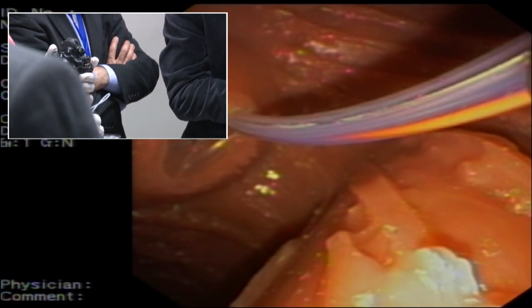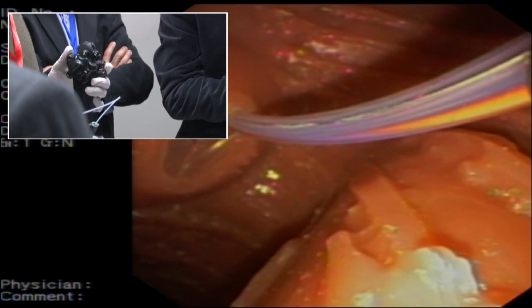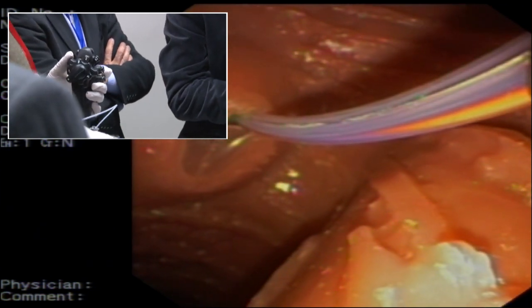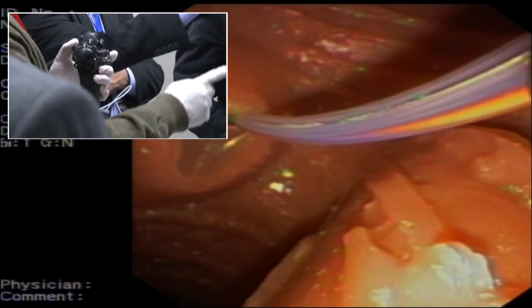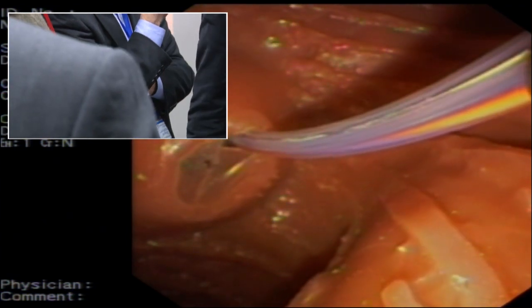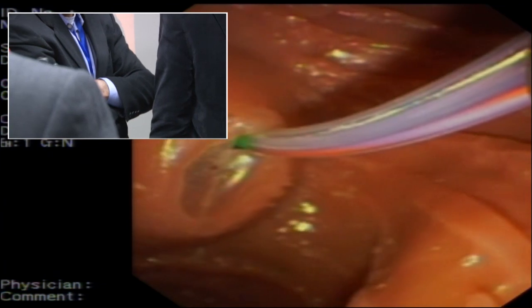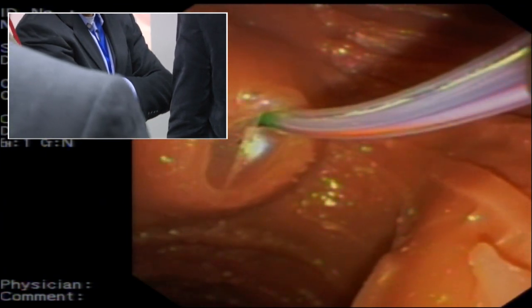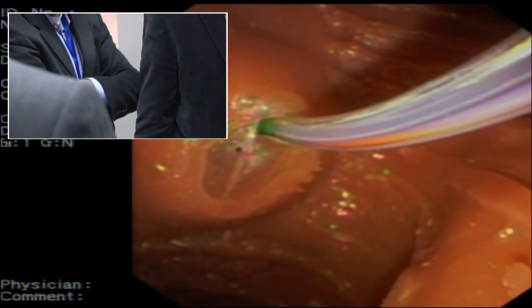While you've got the thing in, you see your ampulla is moved again. Now this is, I'm not happy with that position. So I would bring it back to the way it should be. Try and bring it close to you and straight. What are you going to do? Stop. What do you want to do? You want to bring it closer to you. What options do you have?